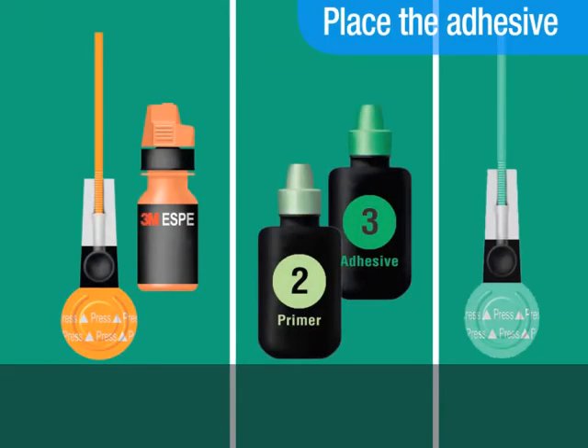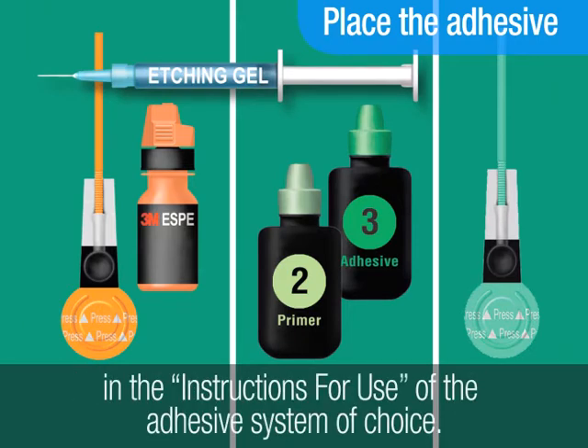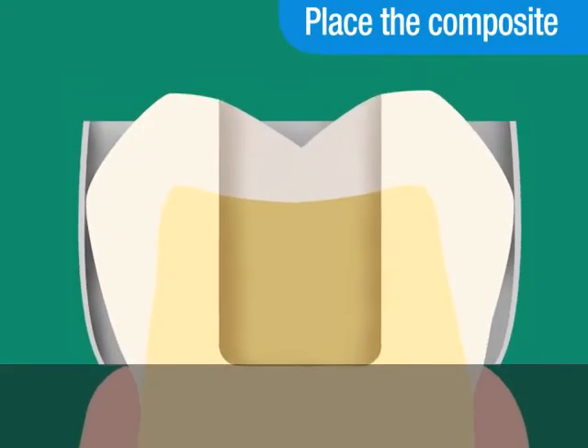Now place the adhesive. Follow the bonding instructions provided in the instructions for use of the adhesive system you've chosen for this restoration.